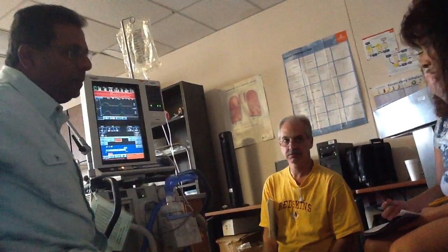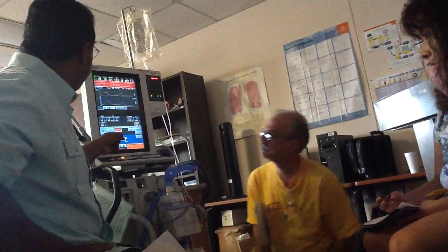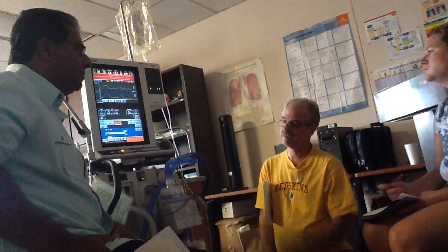But why does it look like it's locked when you push that third TE button? See how the third one's showing unlocked? That doesn't mean anything. But the middle one is locked and is pointing down to 1 to 4. So it has to be pointing down to be locked. Okay. So it's probably safe from this machine's point of view, just do that.